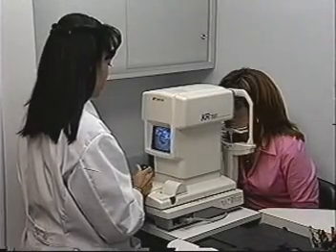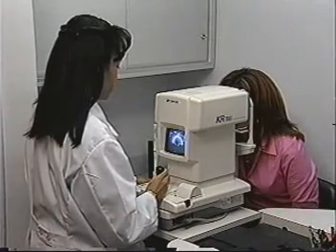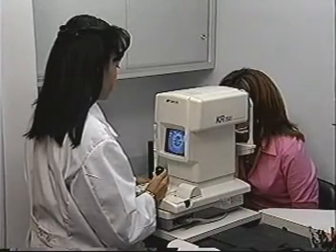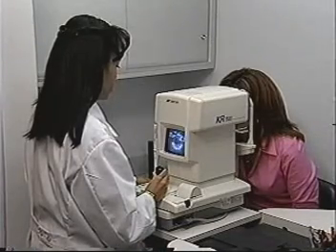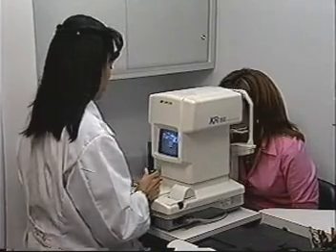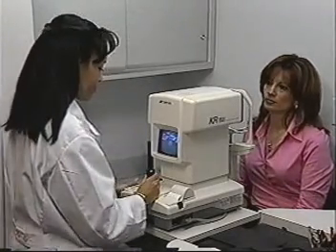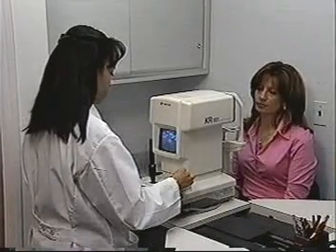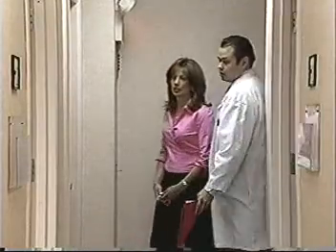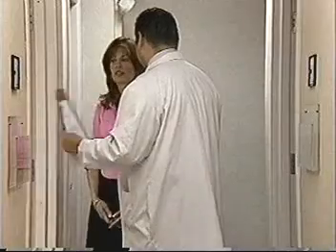Sophia's examination starts with some preliminary tests. The one she's undergoing right now is our basic test to measure what we call the refractive error, that is her amount of nearsightedness or astigmatism that she may have. There'll be other tests to be done. She'll have a glaucoma test done, have her vision tested without glasses, and then we'll take her to other rooms where we're going to perform some other tests. Right here. Dr. Dello Russo is going to come in a few minutes and examine you.